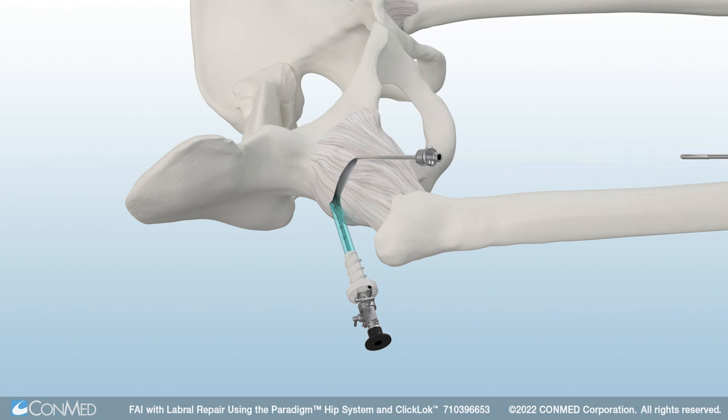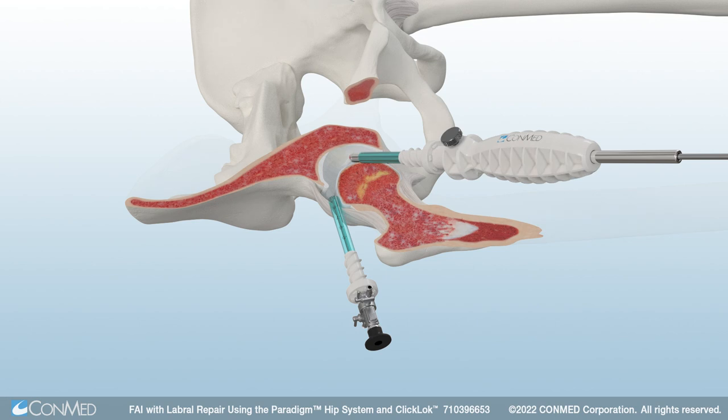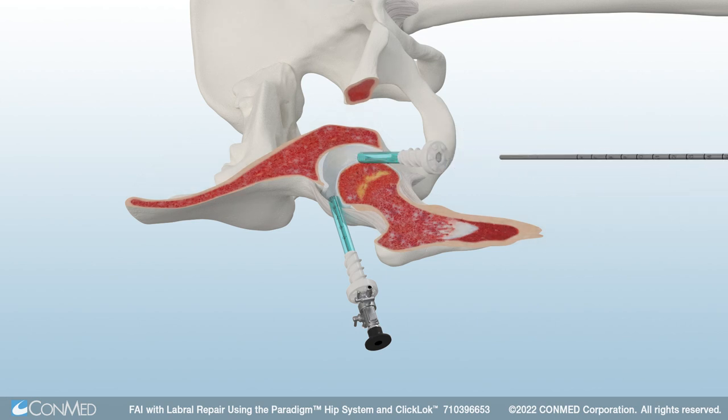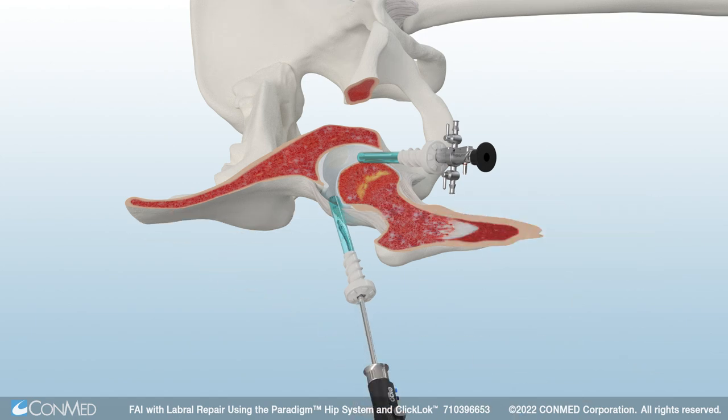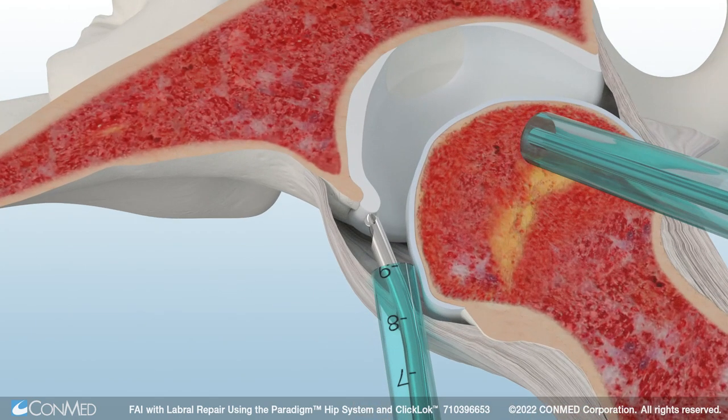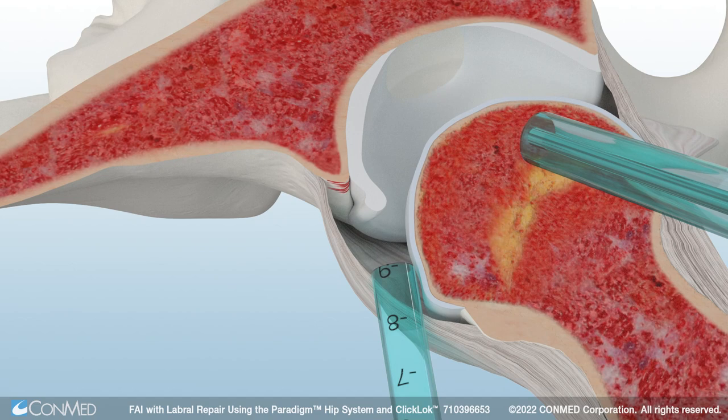The Easy Switch Portal Saver is flexible to allow a wide range of motion and enables easy and efficient switching between portals. ConMed's Signature Series Pre-Bent Burrs feature a 15-degree curve to match the anatomical structures of the hip joint. Use the pre-bent spherical burr to remove the pincer bone.